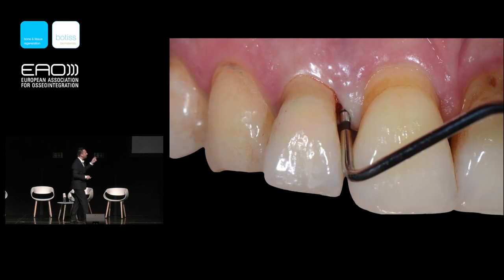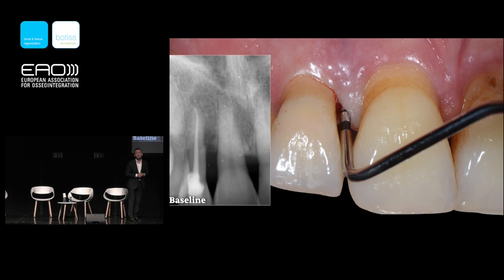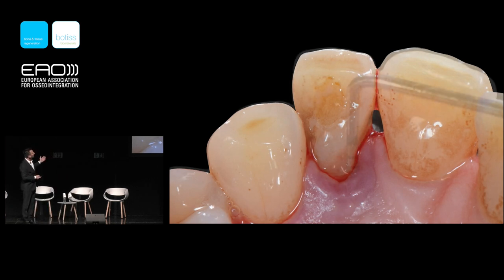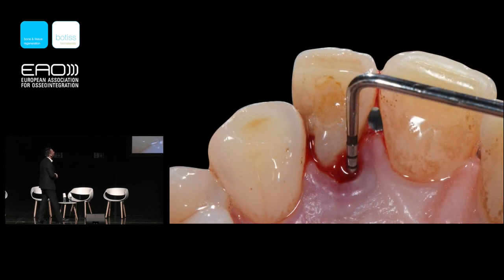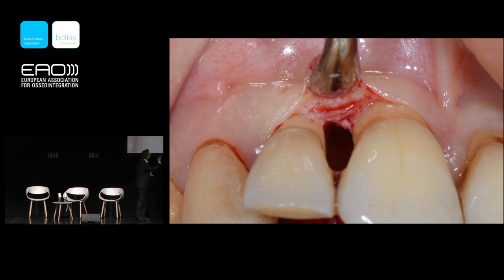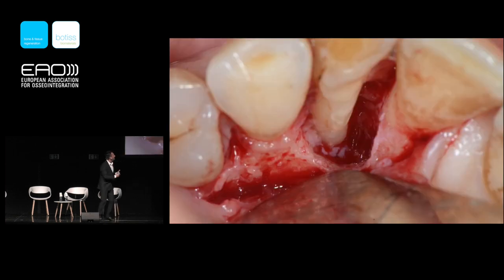We are not going to extract this tooth — we can regenerate it. Although this tooth is not vital, based on the documentation we are not removing it. We need to analyze the defect morphology. When you see the palatal aspect going to 12 millimeters with bleeding on probing, we first provide non-surgical therapy, then reflect our flap. I don't want to reflect the full buccal flap because I can see the residual bone crest.